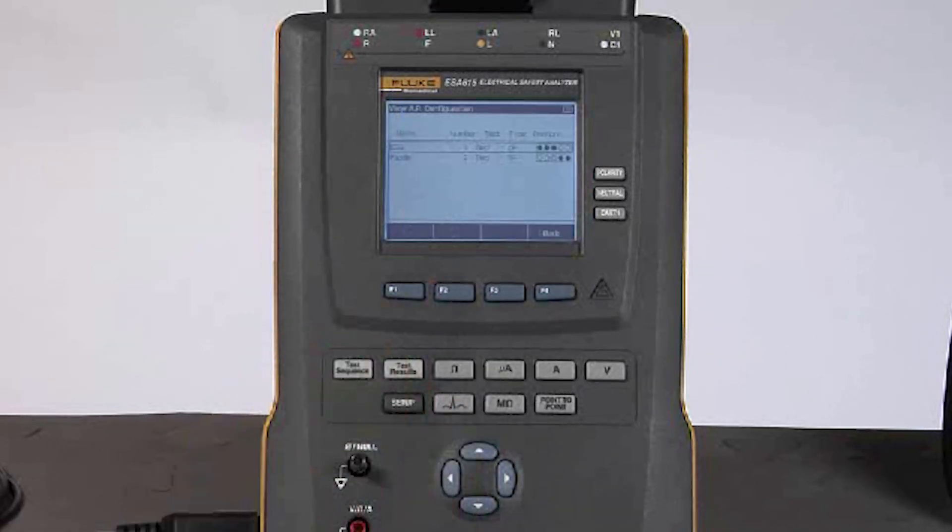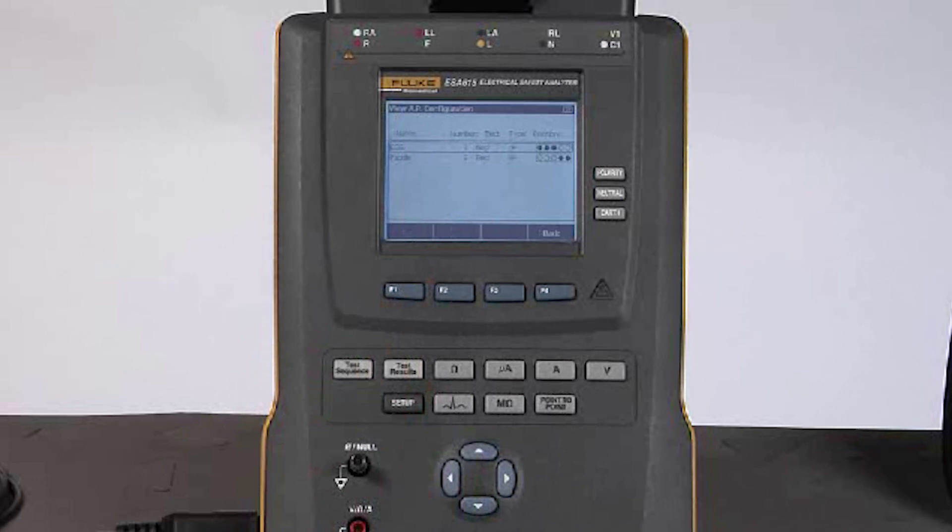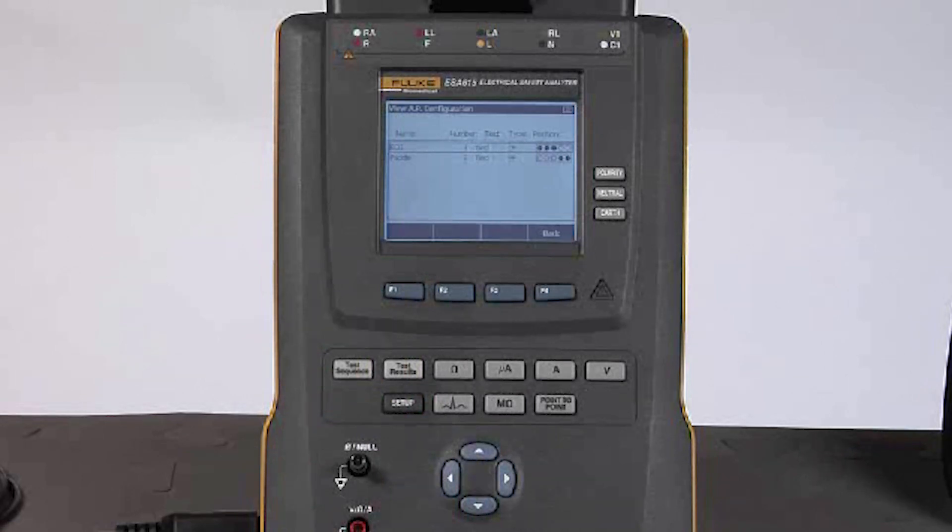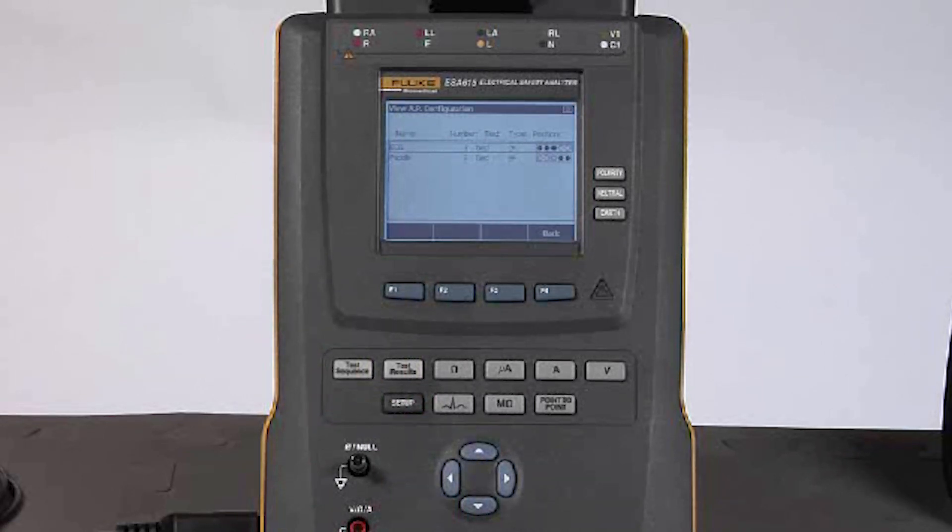The view applied part button allows me to set up my applied part modules—that is, which groups of patient applied connections should be tested together and in what particular way.